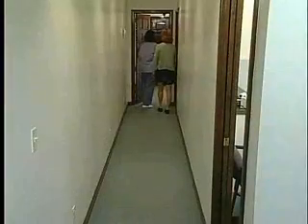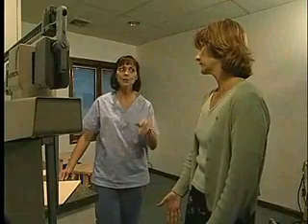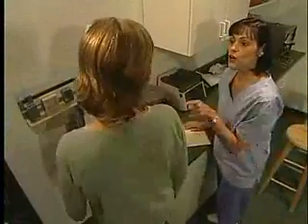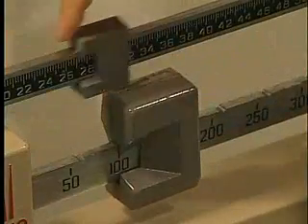Well, before you see the doctor, I just need to perform a couple of tests. First, we're going to step in here so I can weigh you. Can I take off my shoes? Absolutely, I always do. And remember, your chart is not a public document. And I'm thankful for that. But I don't want to know either, so don't tell me, okay?